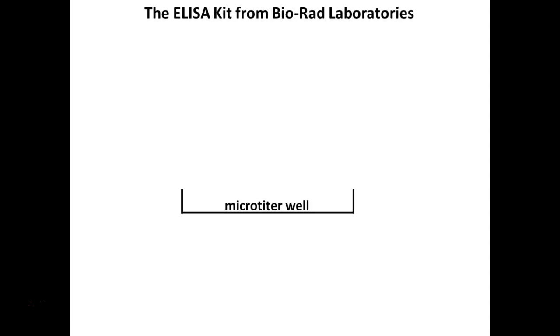So for our kit today, we have our microtiter well that we're using as an immobilizing surface. You're actually starting out with gamma globulin, IgG from a chicken. So our antigen is an antibody we started with today. We stuck that in our wells, and then they took that chicken antibody and stuck it in a rabbit. So then a rabbit made an antibody against the chicken. So you have what's called rabbit anti-chicken antibodies. So guess what we're going to do next?